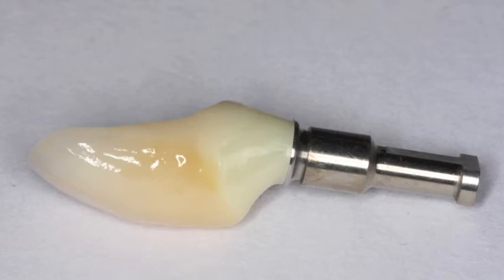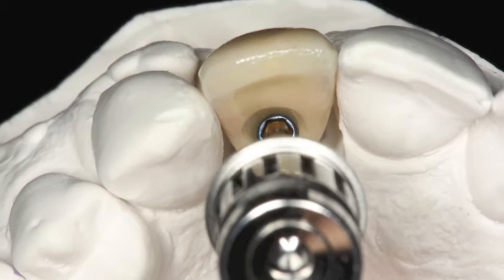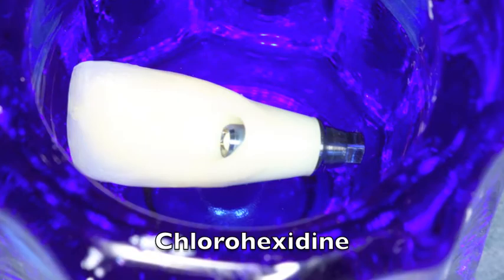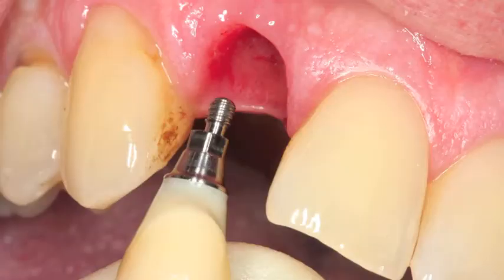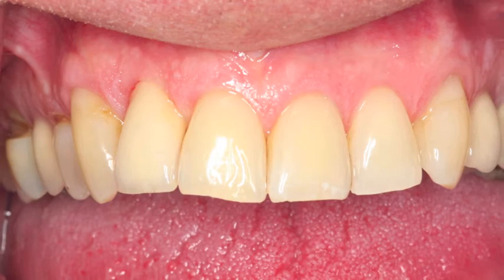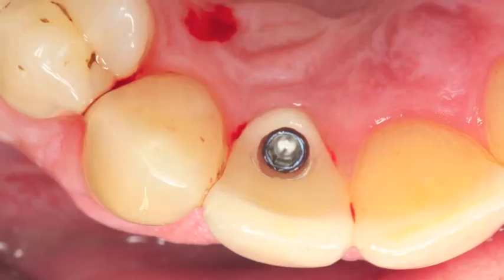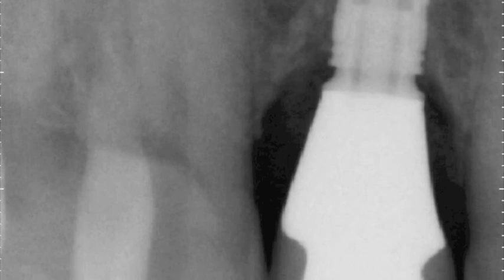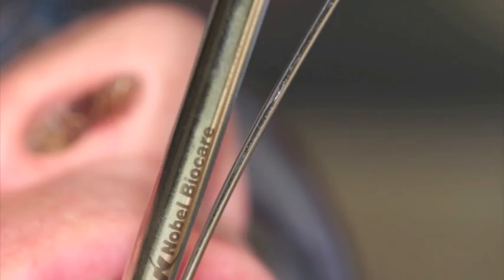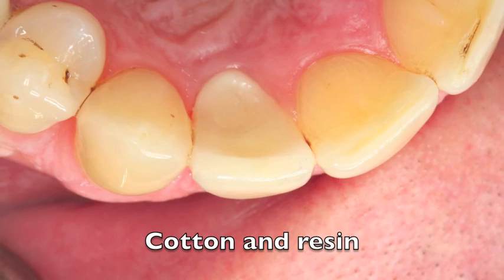Before putting this in I'd like to look at how it goes together and how it would look on an x-ray. We're going to try it on the model first and check the angles. Before putting anything in the patient's mouth I always put it in chlorhexidine because it's passing through the oral cavity and into the body. I go to put this in place, tighten it down by hand, and check the color, contour, and make sure the patient likes it. You can see the little Omnigrip screw — the blue-ended screw — which requires a special driver. We take an x-ray and look at the bone. It's amazing — the bone is right where we want it to be, right at the top of the implant. The abutment has the perfect 0.75 millimeters of porcelain around it because we planned it that way. Now we're going to tighten this down to 35 Newton centimeter torque, which is the recommended torque for long-term stability — hopefully for the rest of the patient's life. We'll put a little bit of cotton in and some resin in the channel, and then the patient's done.